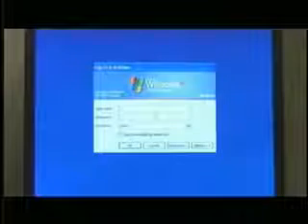Congratulations! You have successfully installed the Valleylab Exchange Software Update System.